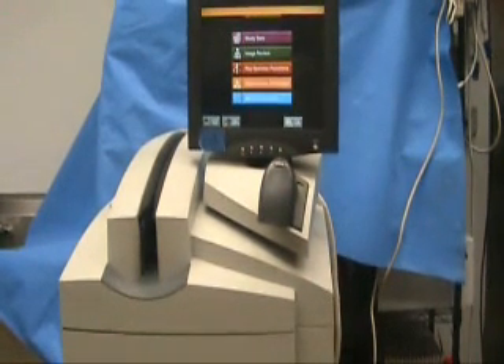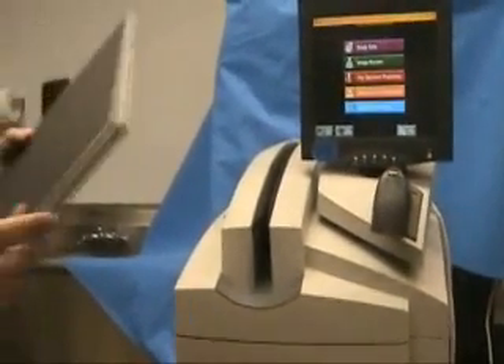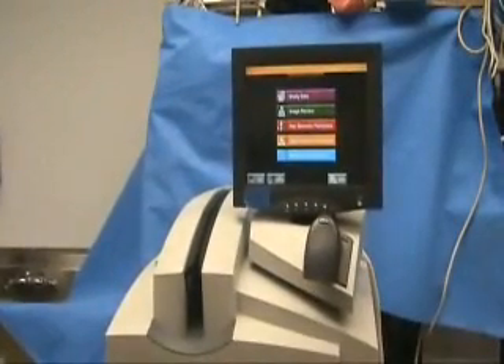The system itself is very simple to operate as we will show you now. We have an example of one of the cassettes. The first thing we are going to do is set up a new patient by entering their information on the touch screen.